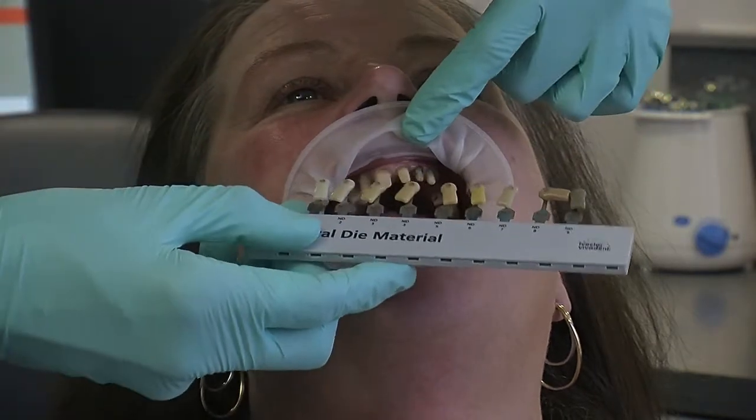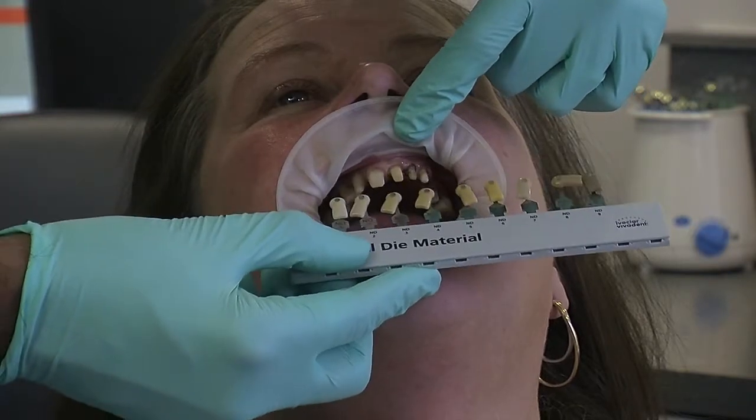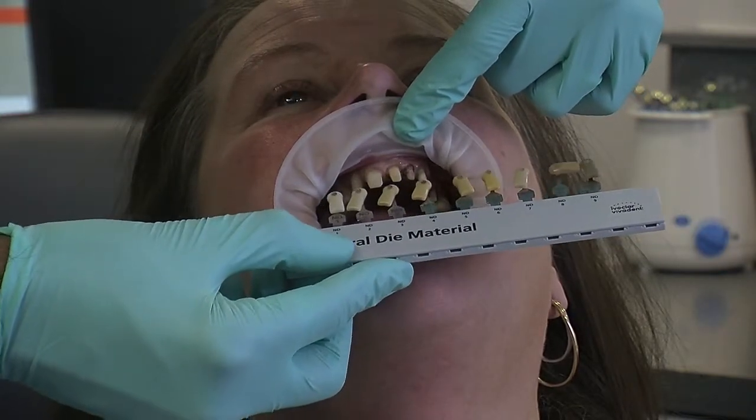Because we're doing all porcelain, all ceramic work, we need to try and get the colours of the teeth ideal.